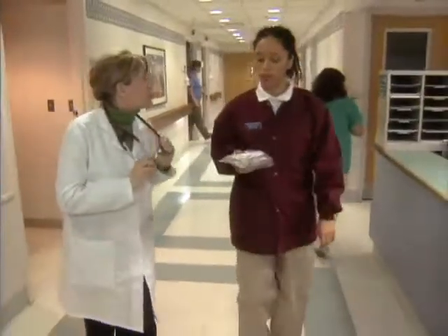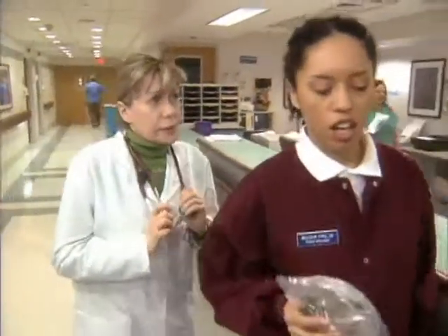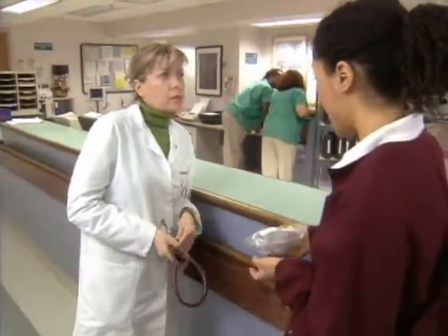I was just looking for you. Can you help me apply a partial rebreather mask? Of course. What's the situation? Well, my patient has had some changes in his respiratory status, and his oxygen saturation has dropped to 89%. So his nurse called the doctor, and the doctor ordered a mask with an oxygen flow rate of 10 liters per minute.